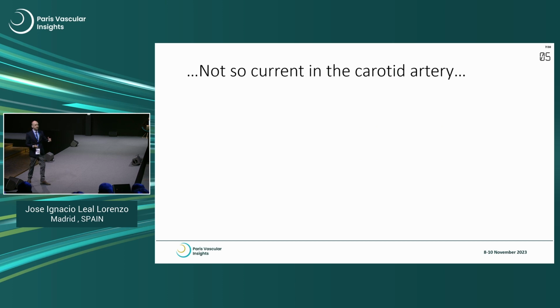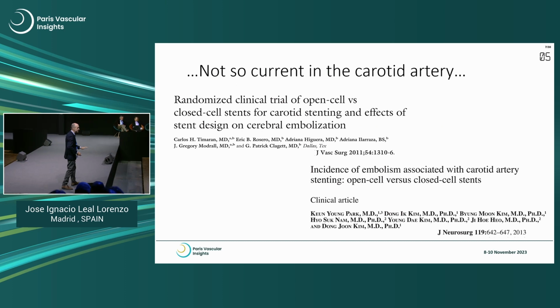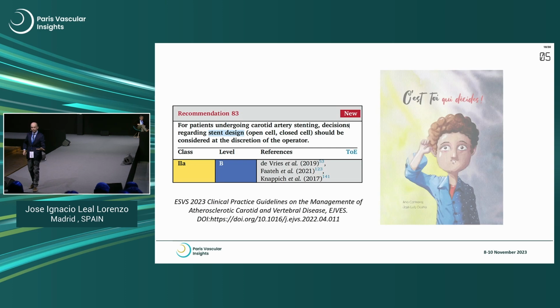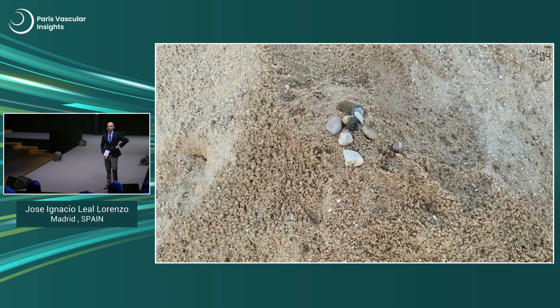And this is probably because we have seen a lot of conflicting results comparing open cell stents, closed cell stents, new designs, and conflicting results always lead to this kind of recommendation: stent design should be considered at the discretion of the operator. I will try this. C'est toi qui décides. Okay, not bad. It's up to you. It's up to you. Okay.